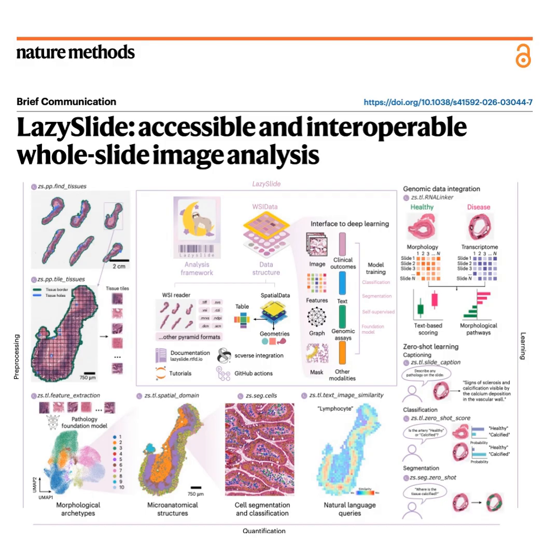The paper tests several of these, right? Models like UNI2, Virchow, H-optimus, and Prov-GigaPath. Right, these are massive neural networks. They use self-attention mechanisms to analyze the physical morphology of the tile. So they're looking at things like the density of the nuclei, the thickness of the cell walls, the spatial arrangement of the tissue. Exactly. And the network translates that visual architecture into a dense, high-dimensional feature vector. Basically, it turns a picture of biology into a complex string of 1,000 numbers. Turning visual patterns into complex math.